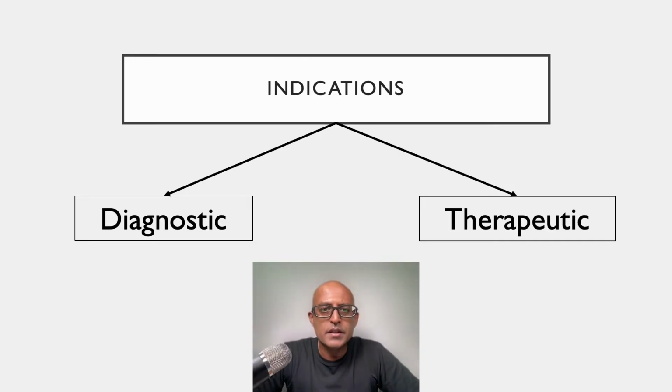So let's think about the indications for any ultrasound-guided intervention. Broadly speaking, we can consider it as either diagnostic or for therapeutic purposes. And this is how I really approach it when I'm speaking to patients, and it helps them understand the purpose of why we're doing an intervention.